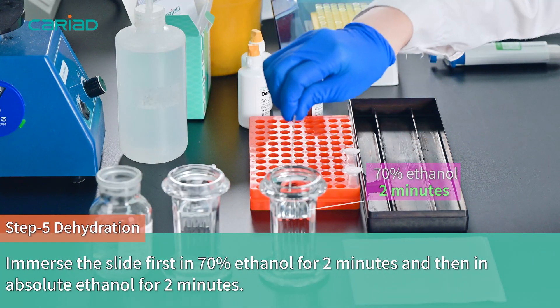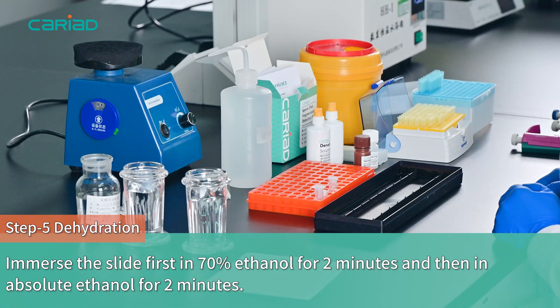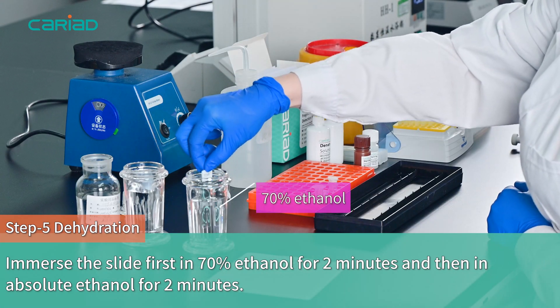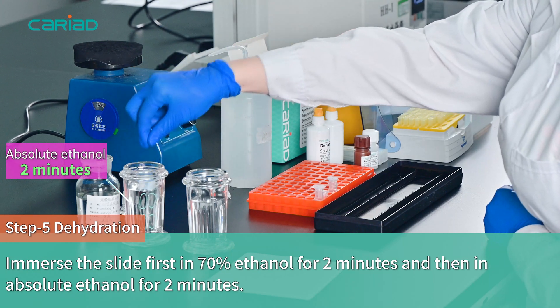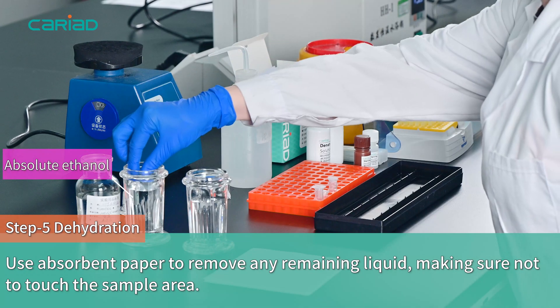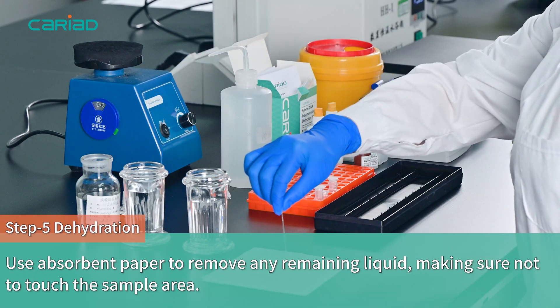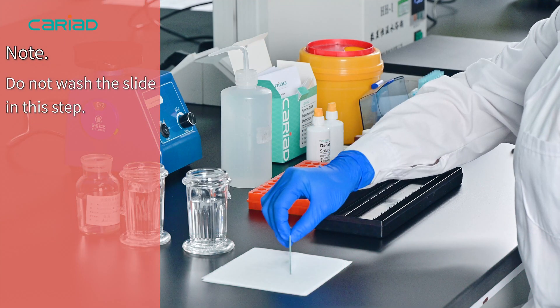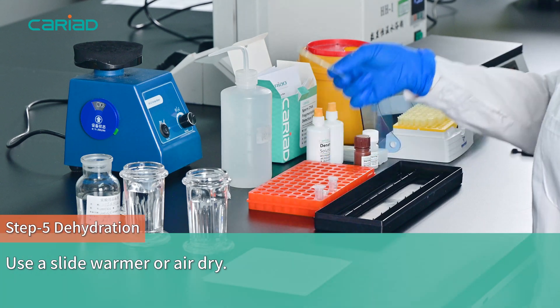Step 5 - Dehydration. Immerse the slide first in 70% ethanol for 2 minutes and then in absolute ethanol for 2 minutes. Use absorbent paper to remove any remaining liquid, making sure not to touch the sample area. Note: do not wash the slide in this step. Use a slide warmer or air dry.